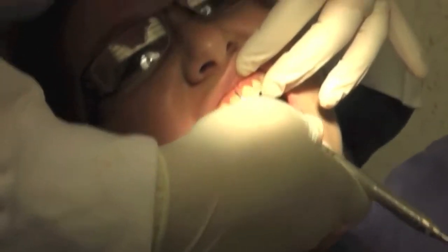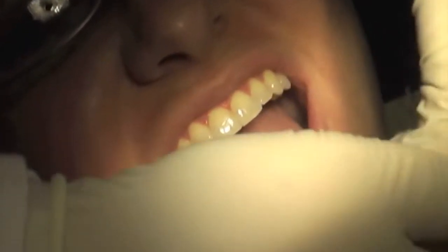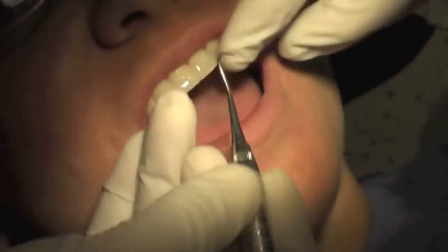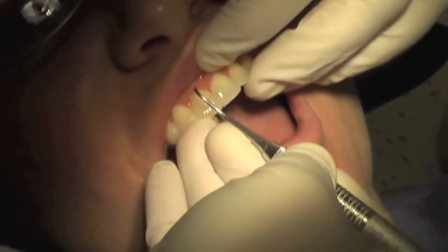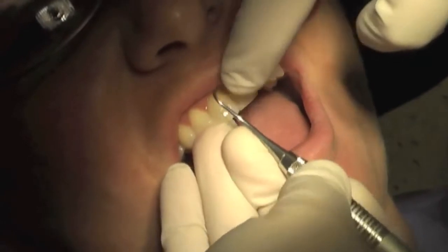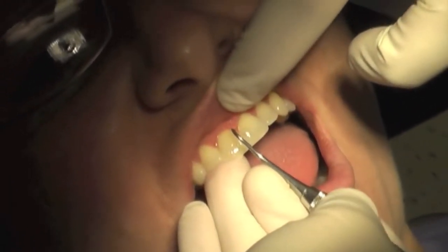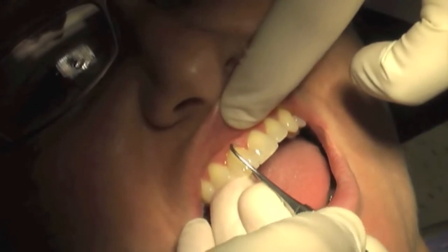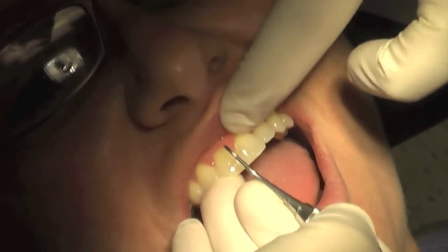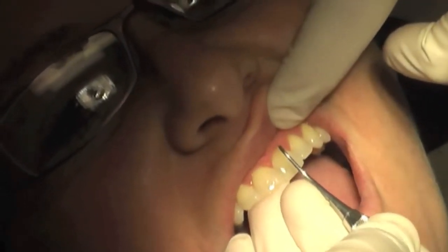You really want to lead with that toe. If you're going to get something out of a cookie jar, you're not going to lead in there with your knuckle and try to pick something up — you're going to go in with your finger and just scoop. That's what you want to think about with this instrument. You need to lead with that toe, scoop up under it, and then use the weight of the heavier part of the instrument to push it forward. You're not going to scoop it out like this — you're going to get under it and use the heavier part to force it off the tooth. So that's adaptation.